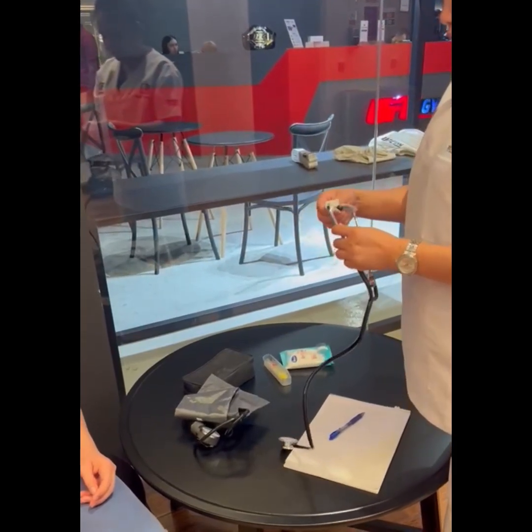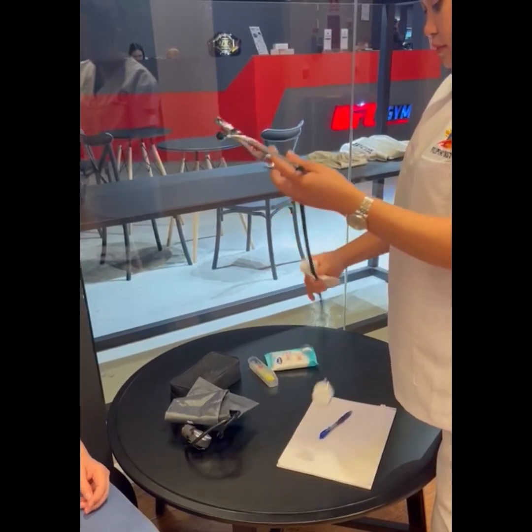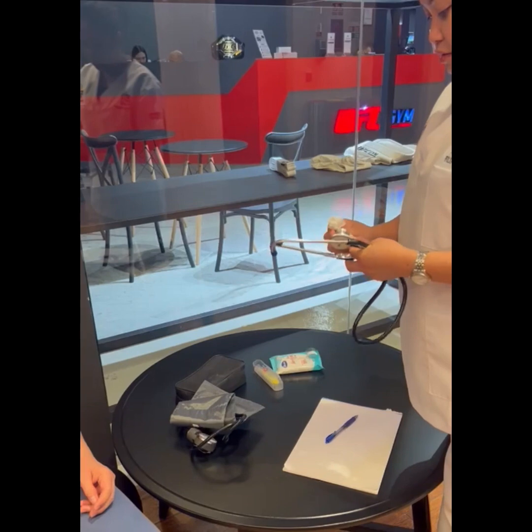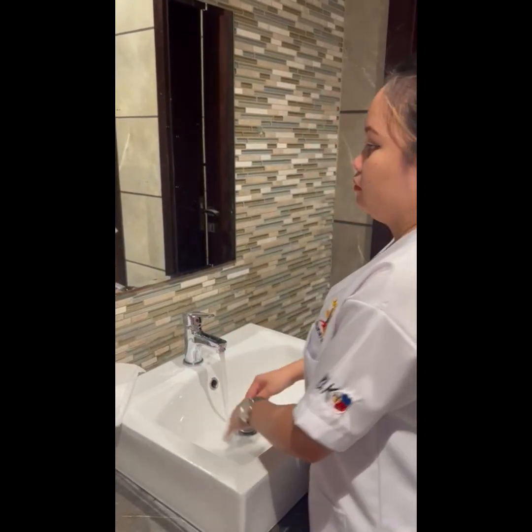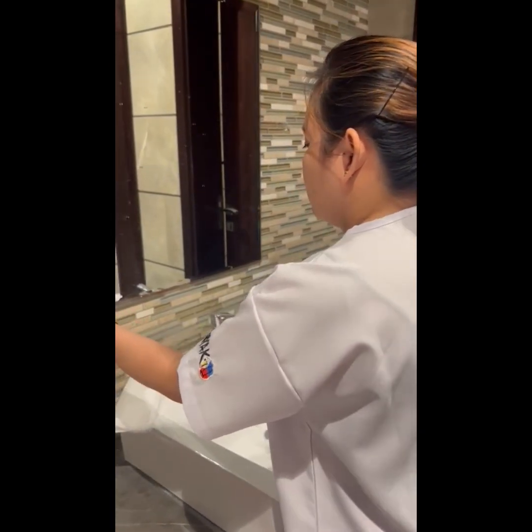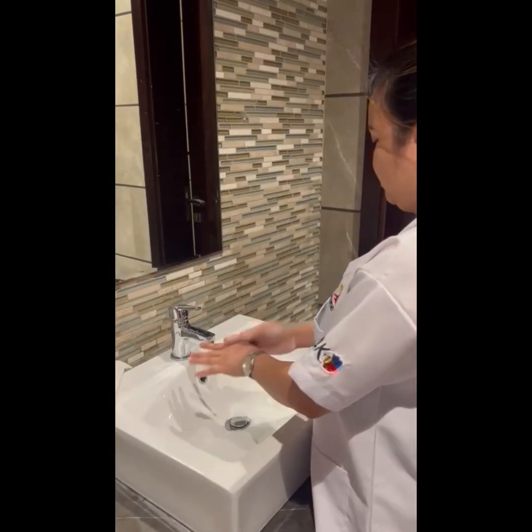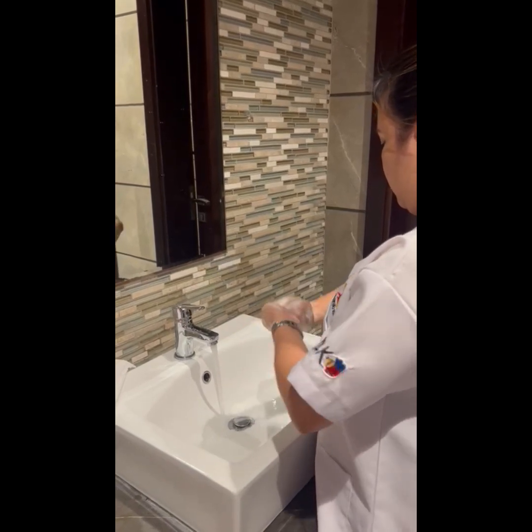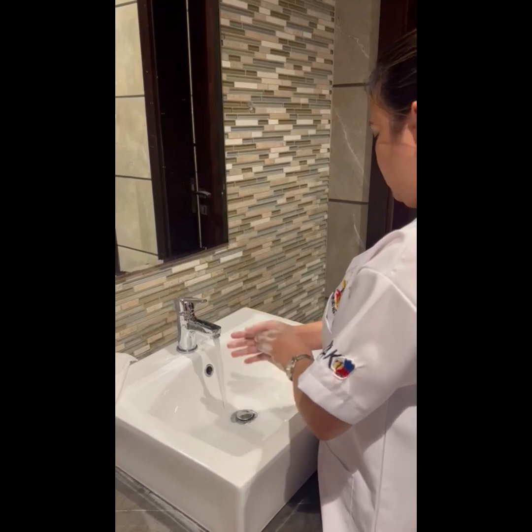Disinfect the stethoscope after every patient assessment with 70% isopropyl alcohol solution. This is to help reduce the risk of patient-to-patient cross-contamination. Lastly, perform hand washing. Stethoscope diaphragms are contaminated with some pathogens like the hands, and they are capable of transmitting pathogens from patient to patient.